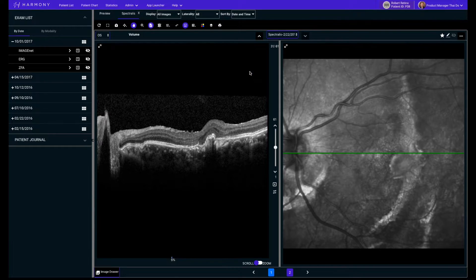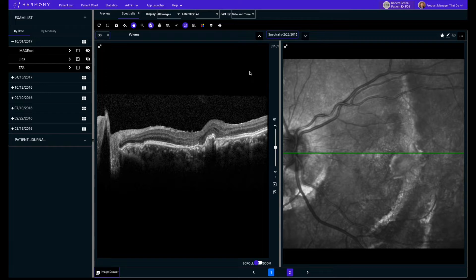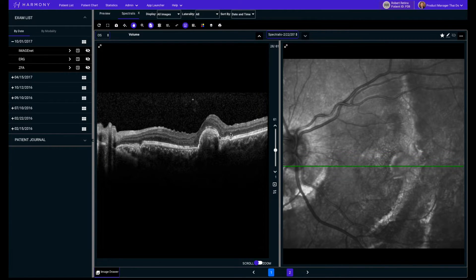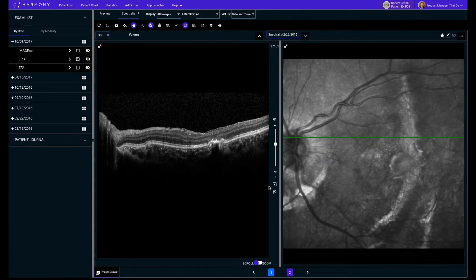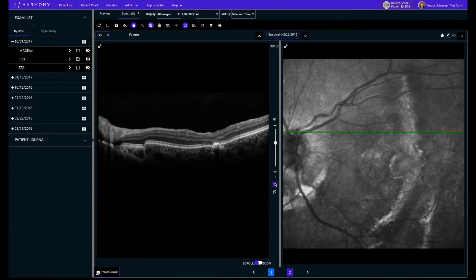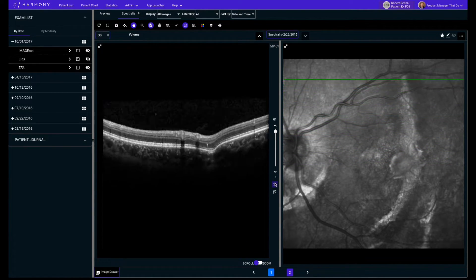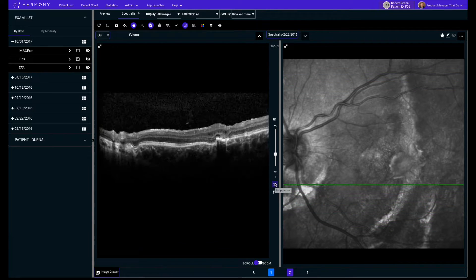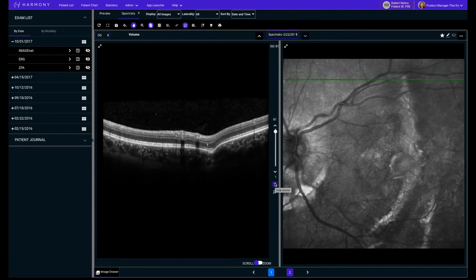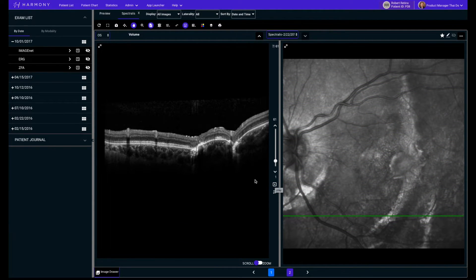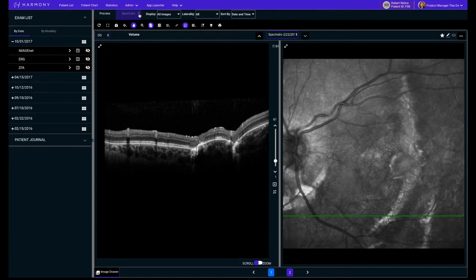Double-clicking a dot will open the first image of an exam in the large viewing area for you to review. Harmony lets you scroll through your B-scan volumes from OCTs. You can also play through them in a loop.